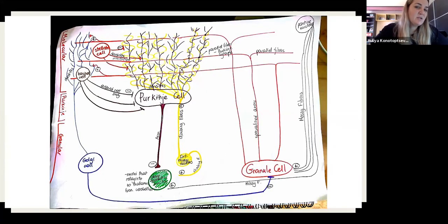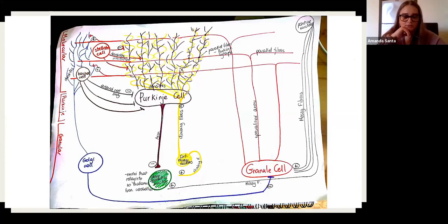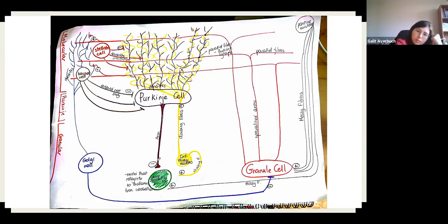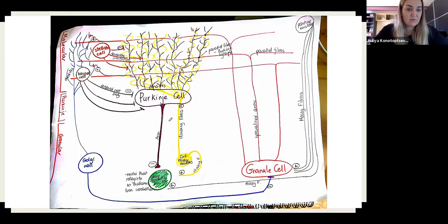But do you see that that's technically not true? What is the one thing which is sitting in the Purkinje layer? The cell body of the Purkinje cell. Only the cell body of the Purkinje cell is sitting in the Purkinje layer. The dendrites of the Purkinje cell are sitting in the molecular layer, and the axon is sitting in the granular layer. Is it clear? So you can see it's one huge neuron, and this one huge neuron spans through the entire cortex of the cerebellum.